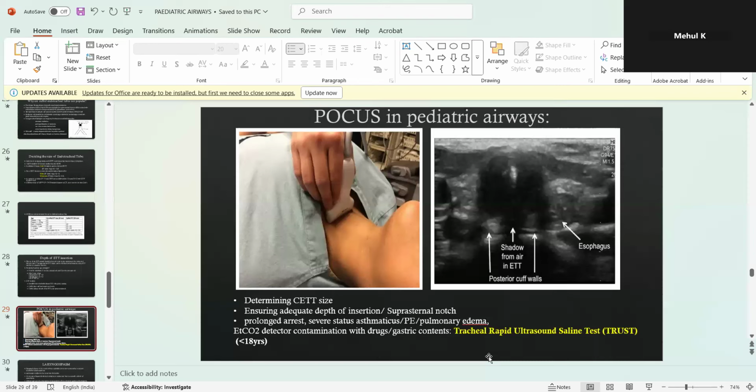You can change the depth of insertion as you perform the ultrasound, and they have reported that within 4 seconds we could ensure adequate depth of insertion. We might take some more time, but so they came up with that. So that's the new concept.